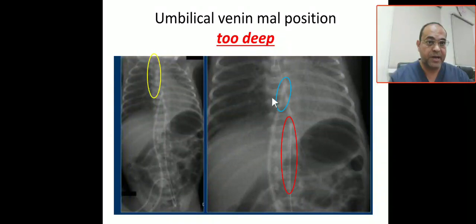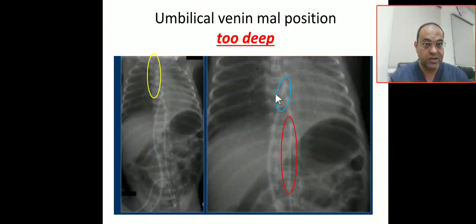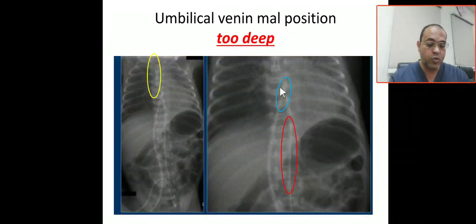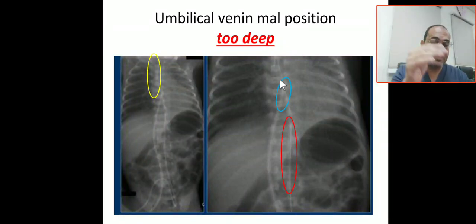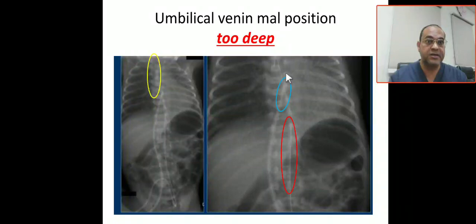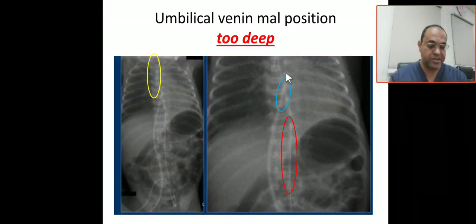If you see here the umbilical vein — marked in blue — it is actually too deep. This is malposition of the umbilical venous catheter. The proper position should be in the inferior vena cava, just at the level of the diaphragm. But here the umbilical venous catheter goes from the inferior vena cava to the right atrium, through the foramen ovale or atrial septal defect, into the left atrium, and can even go to the pulmonary veins. This abnormal position of the umbilical vein catheter in the heart can lead to perforation and arrhythmia.